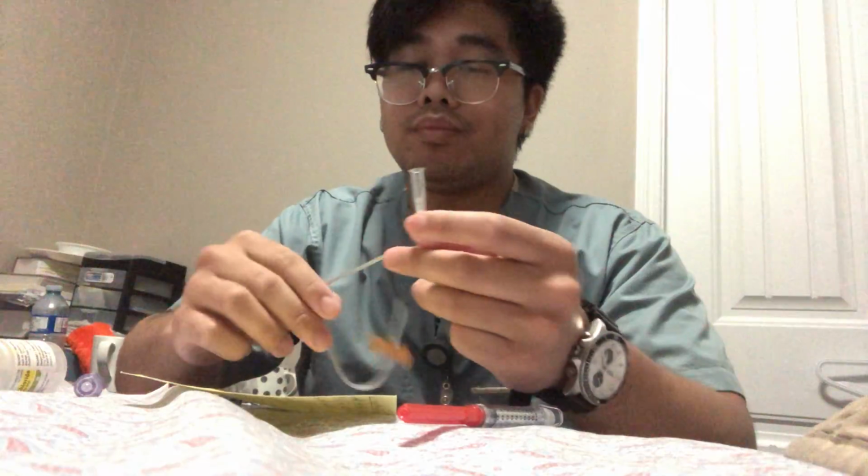So before I even start checking my equipment if there's any damage or anything like that, I'm also applying alcohol swab on all of these to prevent contamination. And now I will begin. So first off, I'm gonna open my blunt fill needle. So here's my blunt fill needle on the package.